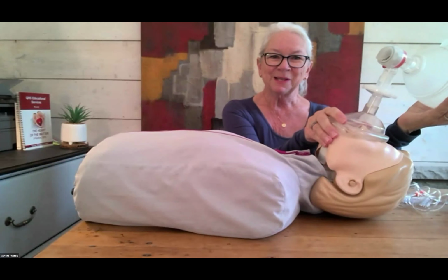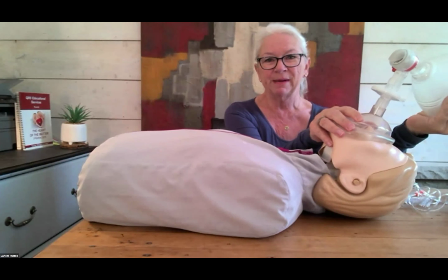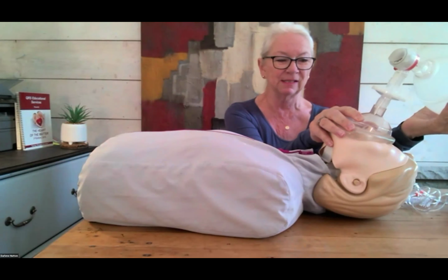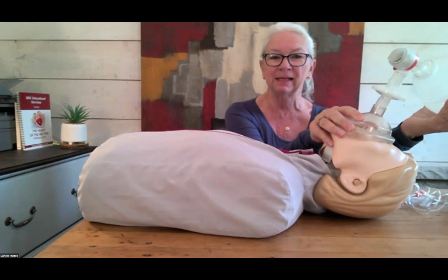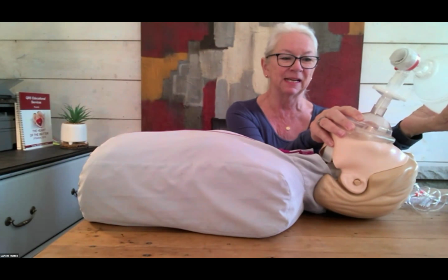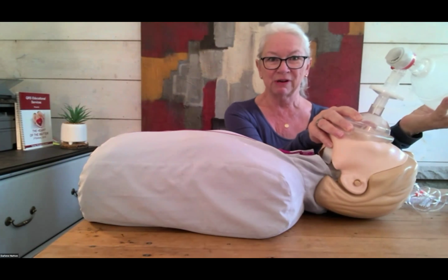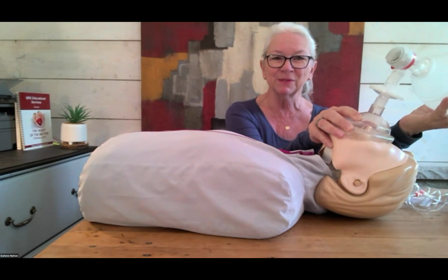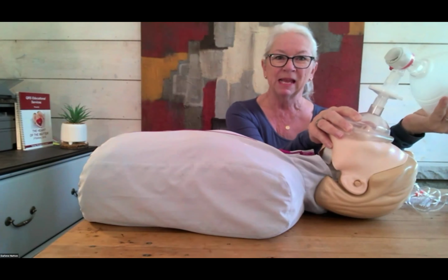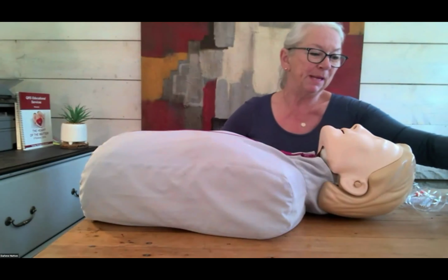So let's talk about SLOPE. You're doing this for a patient who is in respiratory arrest. You've called the physician stat, and you are anticipating that this patient will be needing to be intubated with an advanced airway. So while someone is taking care of the patient's ventilatory status, you need to go to the crash cart and look for all of those letters that we talked about in the acronym SLOPE. And of course, for all of these procedures, you will be donning your PPE.